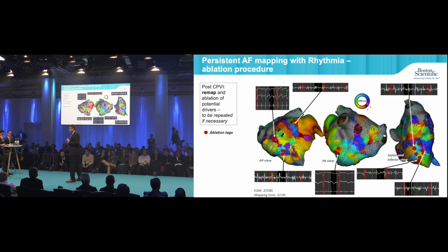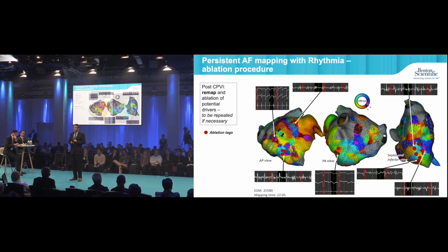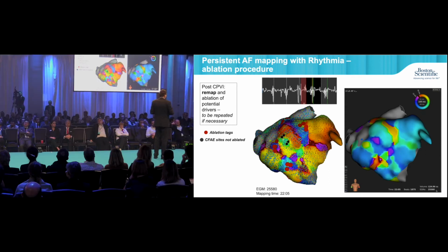Now, we are ablating these specific sites, a limited amount of ablation in each case, and in this particular case, we avoid ablating some fragmented sites which correspond to collisions. And they are highlighted in this image by the black dots, by the black tags.